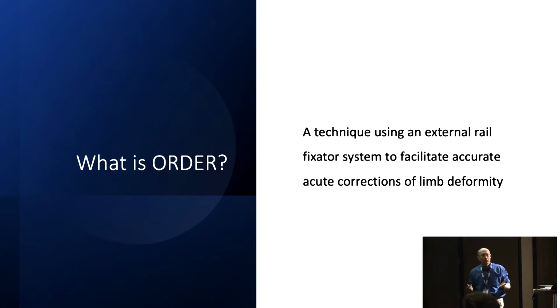And who is it for? Well, it's for any patient who you think would prefer not having an external fixator on their leg after deformity correction. It is also suitable for what I call fixator negative patients. We've all seen them. You've met them, you've met their families, and you think, this patient will not cope with a fixator. So those are the fixator negative patients that this technique is suitable for.